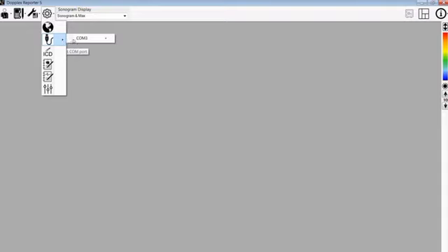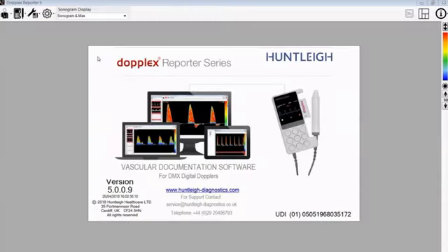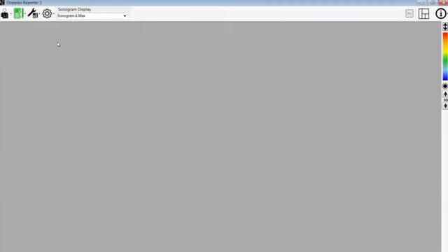This is now in fact the incorrect COM port that I am using, so I will now switch it back to COM 6. You can now see that the green Doppler symbol will appear and allow for connection to the Doppler.